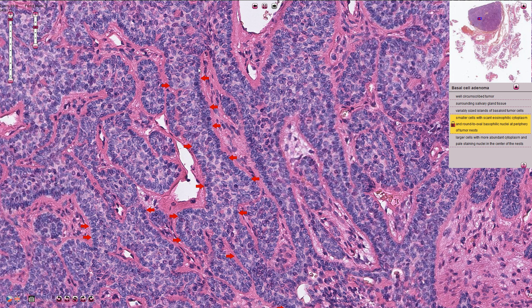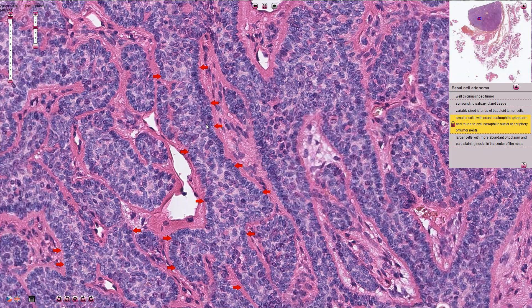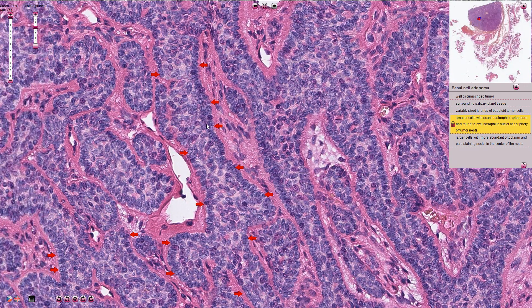On the periphery we can see smaller cells with scant cytoplasm and with round to oval shaped basophilic nuclei. We can also see some prominent palisading here and there.